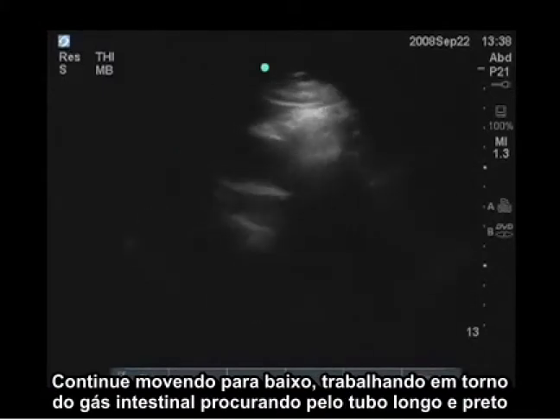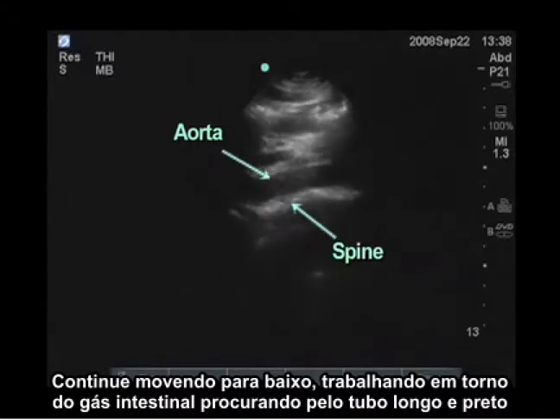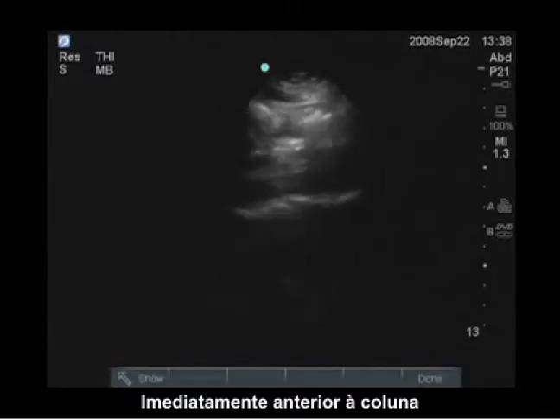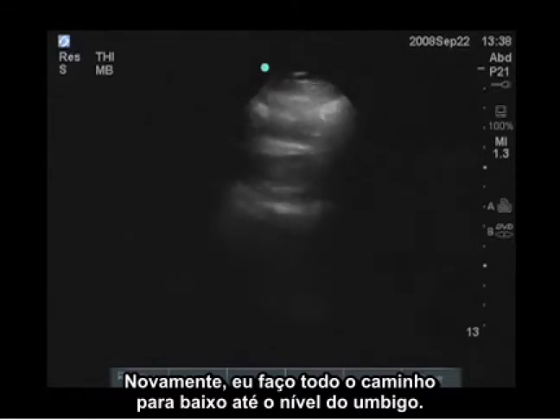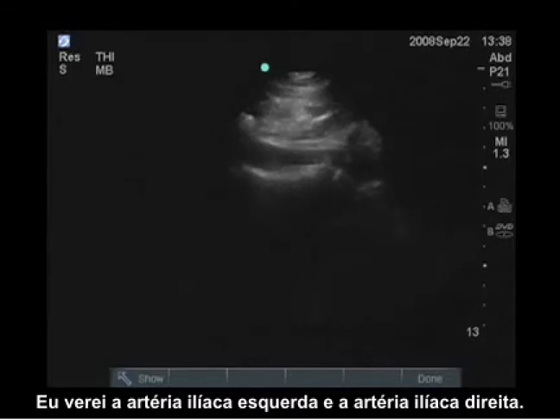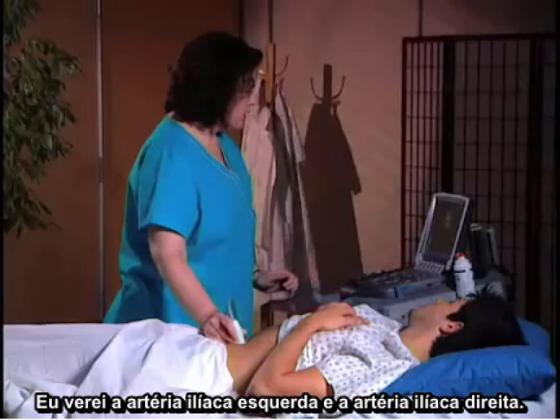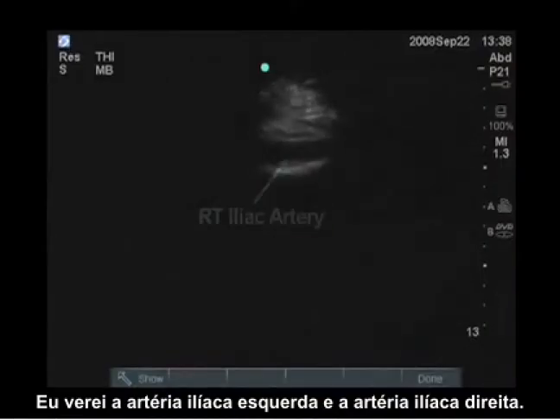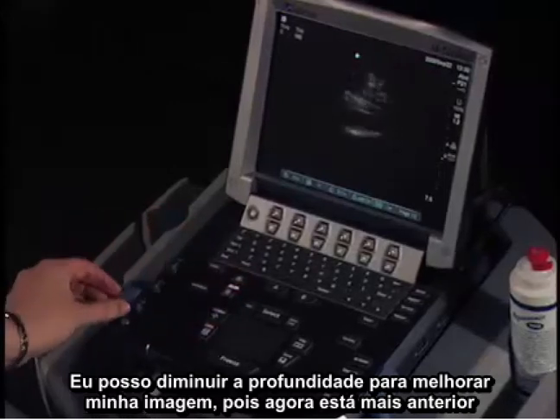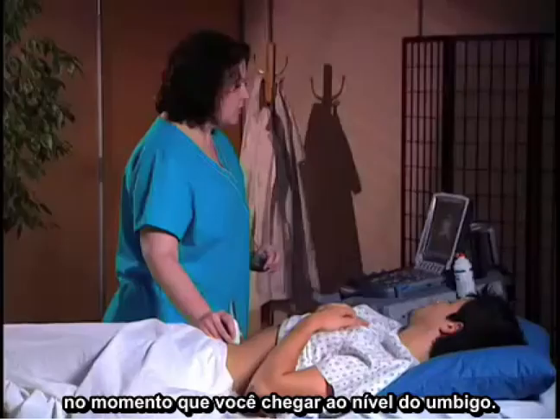And I keep moving down, working around the bowel gas, looking for that long black tube immediately anterior to the spine. And again, I do this all the way down to the level of the umbilicus. And I will see a left iliac artery, and a right iliac artery. And again, I can decrease the depth to optimize my image because it is so anterior by the time you get to the level of the umbilicus.